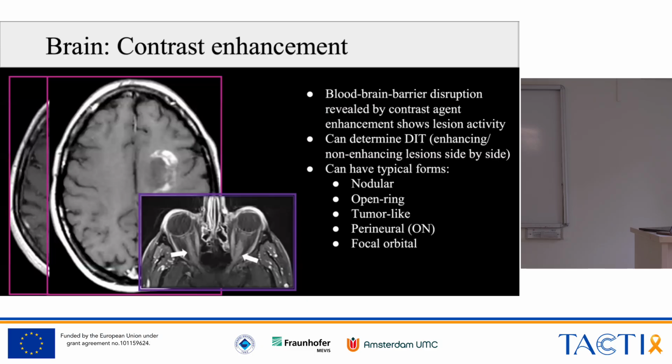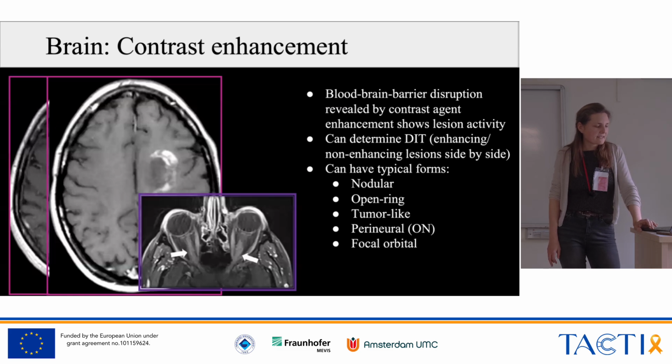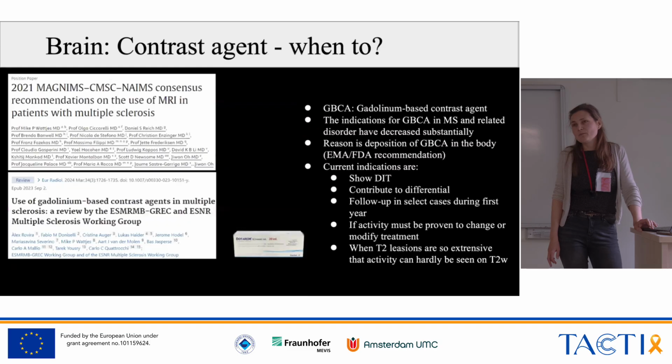There, first of all, the sequences often do not have the quality that you would expect. And secondly, there's a lot of debate. My colleagues and I are doing a study on a related disease, not MS, but a MOGAD study we'll talk about later. And there's hardly ever consensus in the study regarding optic nerve enhancement. And people are, I don't know, 2 radiologists, 4 opinions.